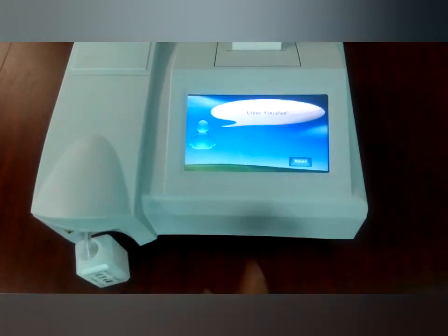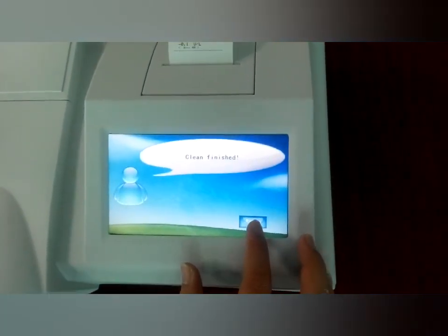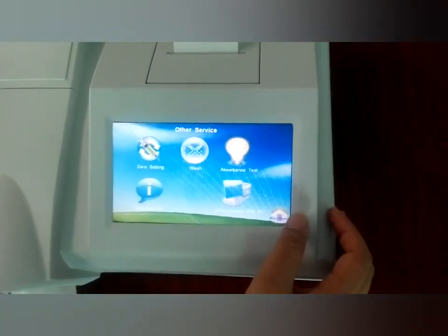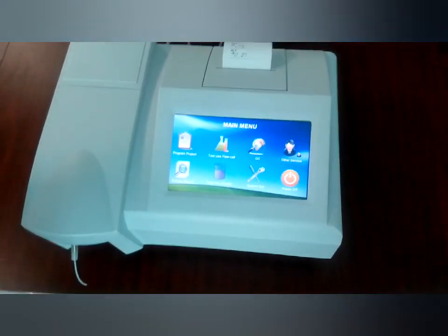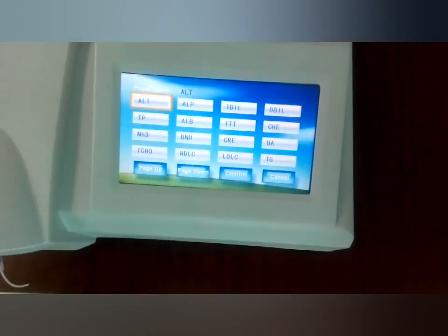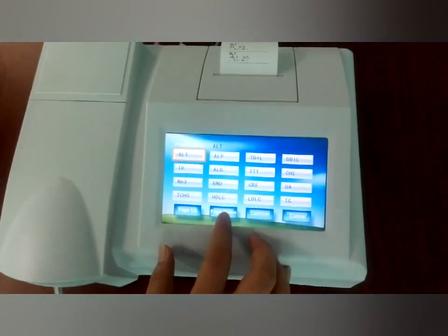After finished washing the tube and the flow cell, we just return and go to the main menu. Now we can do the test. By the way, before we do the test, from the program settings you can see more than 14 items you can test from here.